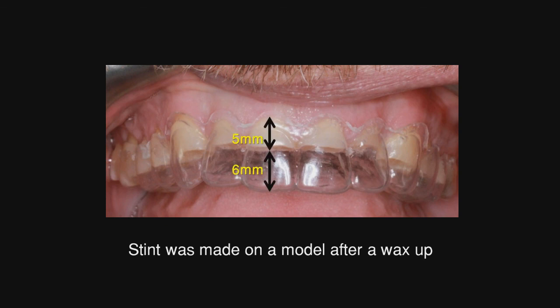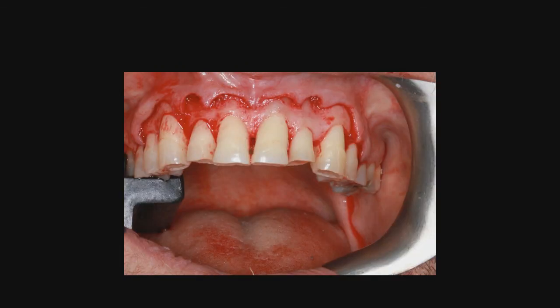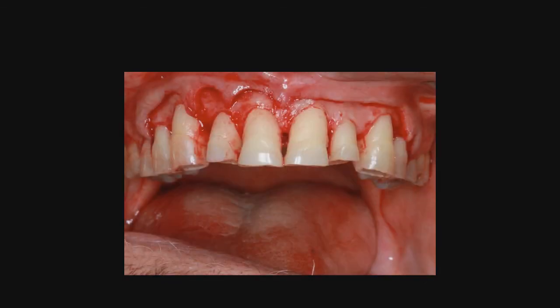Because the length of the tooth is only 5 millimeters, and we want it to be 11, so the prosthodontist on this case ultimately is going to add 6 millimeters. So here the incisions have been made, and the osseous surgery is being done, as well as on the lower. And we can notice now that the tissue is higher on the distal facial of number 8 versus number 9, so Dr. Mantor has really progressed in the years since he's graduated from his residency.